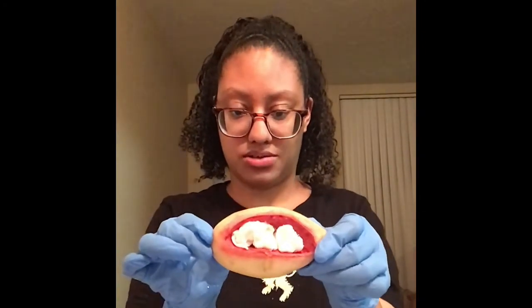You want to make sure that you are not touching the outside of the wound, because if you do, you're going to have to start over. And your packing should look like this.